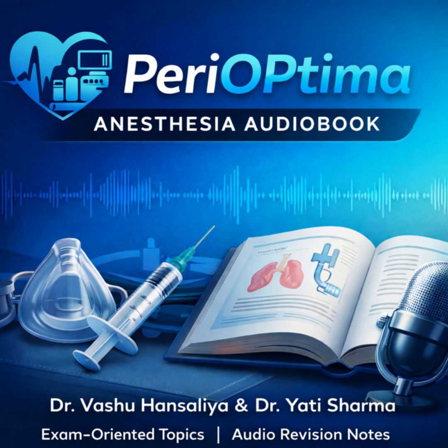Okay, here we hit the heart of the evolution. The second-generation SGADs. These are the exam favorites because they directly address those first-generation safety gaps. What is the fundamental design difference we need to focus on? Right, we're focusing on safety and performance enhancement, and the most defining feature is the gastric drainage channel, the GDC. The GDC runs parallel to the airway tube, and it serves a critical dual function.